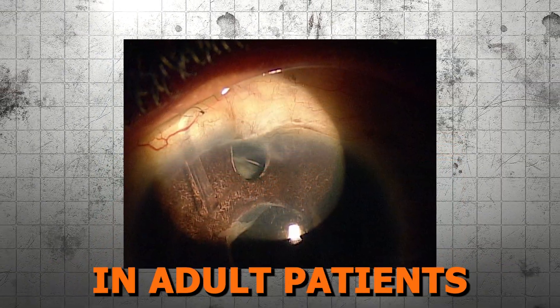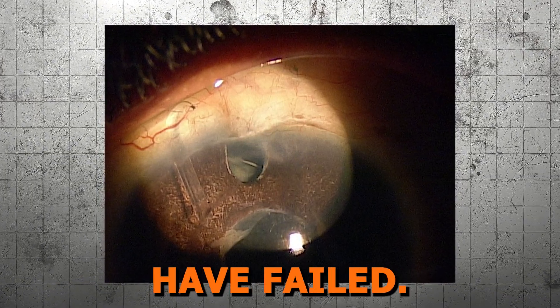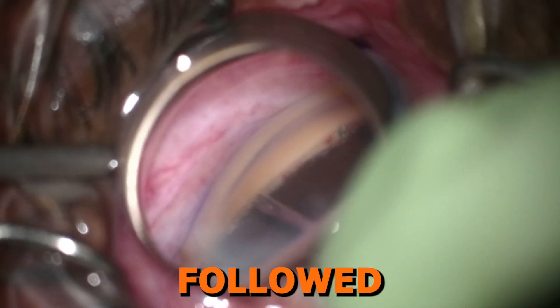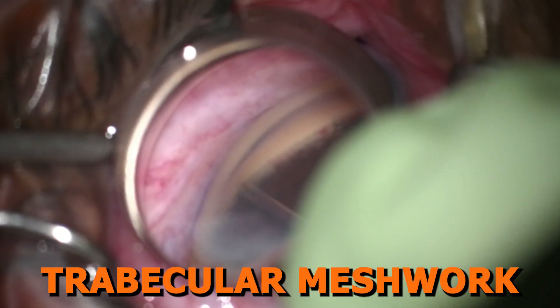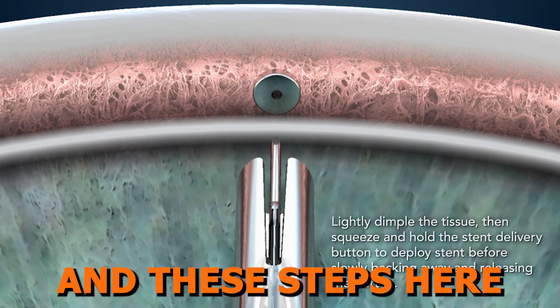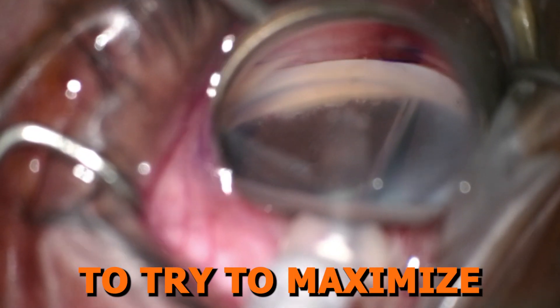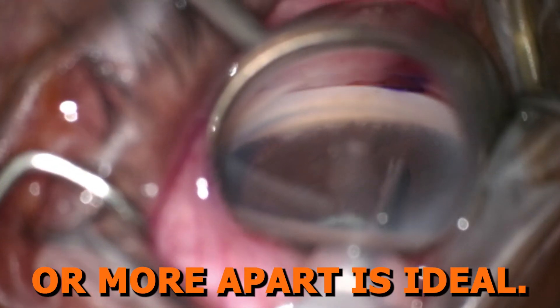It is indicated for use in adult patients with primary open-angle glaucoma in whom previous medical and surgical treatments have failed. Here is the iStent Infinite in surgical action, where there is alignment of the trocar to the central TM, then a forward dimpling of the tip, followed by pressing of the inserter button to release the device, which pierces through the trabecular meshwork into Schlemm's canal and is seated. A lever is pulled back to reload the inserter for the implantation of the next stent, and these steps are repeated to the left and the right of the initial stent. Targeting insertion of stents at least two clock hours or more apart is ideal.